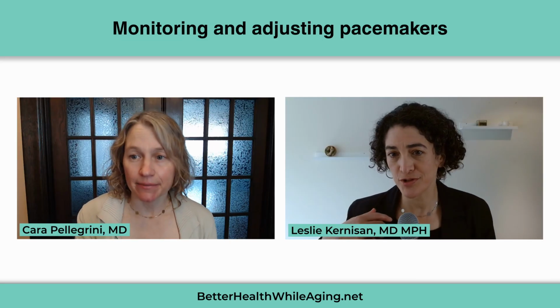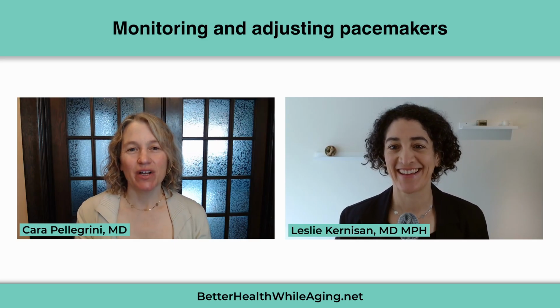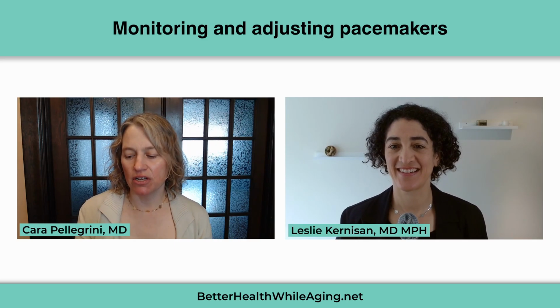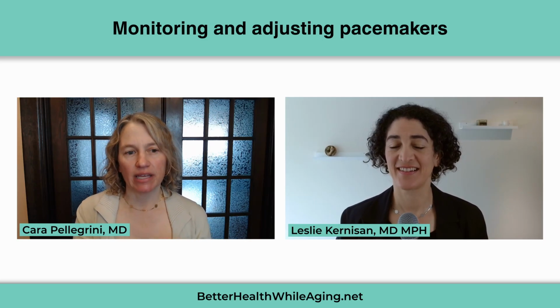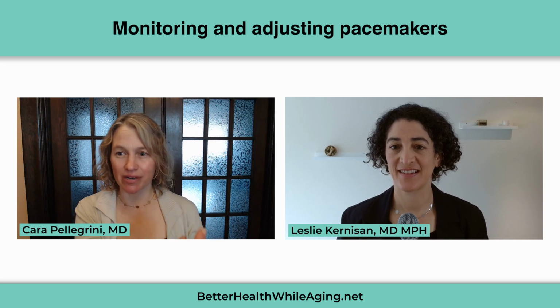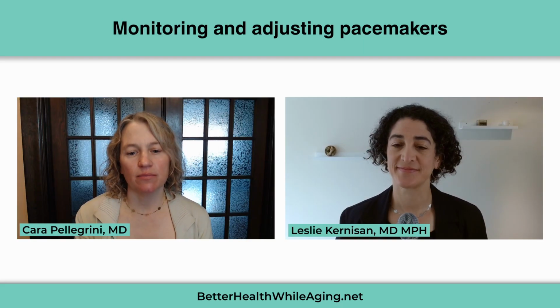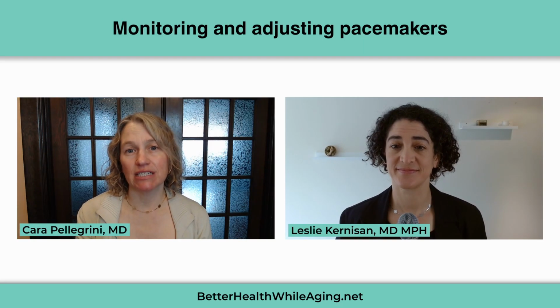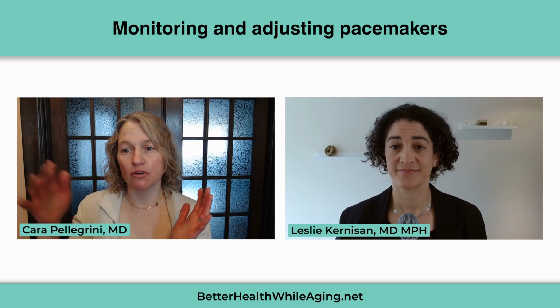And what do you do during the in-person visit to tell the pacemaker how to change what it's doing? Yeah, so we'll use some sort of computer type device, and often there's an element that will go near the patient's device. Although, again, with many of these devices that have radio frequency energy, it can be just a quick ding, like your phone, and then you take it away. And then we're able to see what the device has kept track of, like a histogram of what your heart rate has been over time.